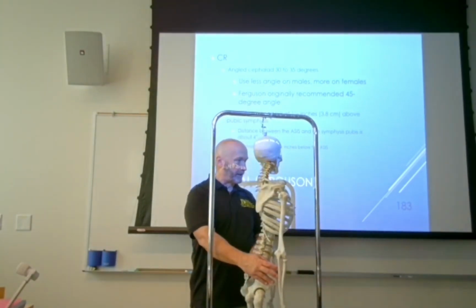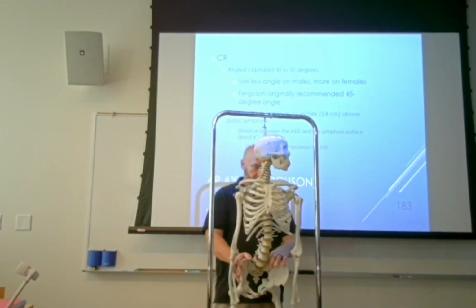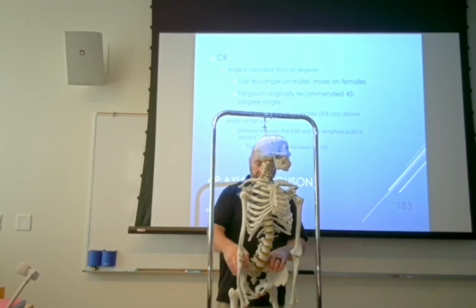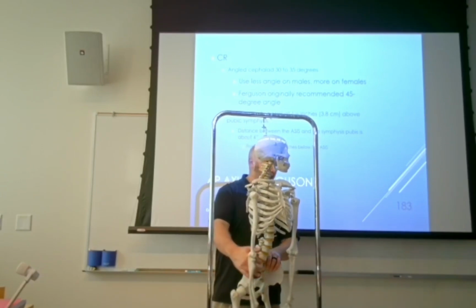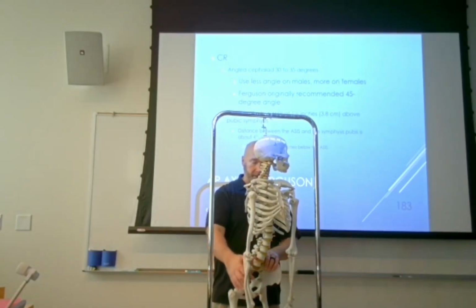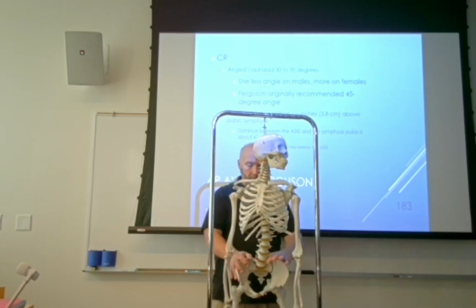Can you kind of see how quickly they, yeah, it doesn't take much of an oblique to get them, one, on top of each other, and two, that's where you're going to center, essentially. Just medial to, not as far medial as what we did on the L-spine, but just medial to the elevated ASIS. Okay, those are your obliques.